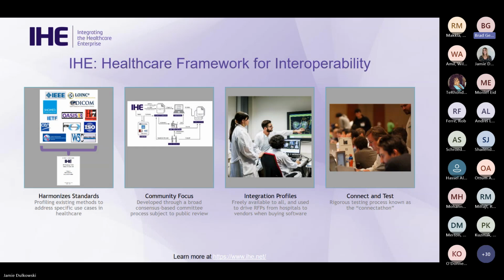There's not only the drafting and development of the profiles themselves, but also activities around validating applications, using events like connectathons to test these applications together year after year, in North America, in Europe, and in Japan, to drive this forward. Go to the next slide.